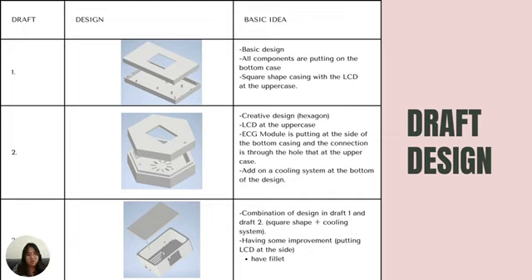For draft 2, we introduce a creative design using a hexagonal shape, with the LCD also at the upper case. The difference between draft 1 and draft 2 is we add one cooling system at the bottom of the design, and the ECG module is not placed on the bottom case but at the side of the bottom case. Draft 3 takes the advantages and ideas from draft 1 and draft 2. We design it using the square shape, and we also have a cooling system on the bottom case.